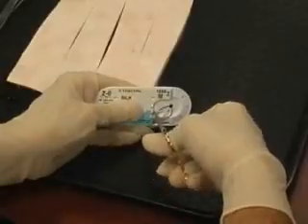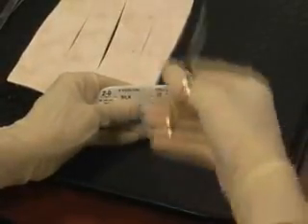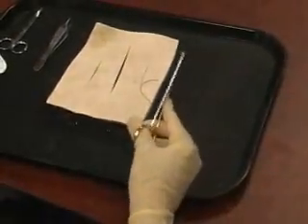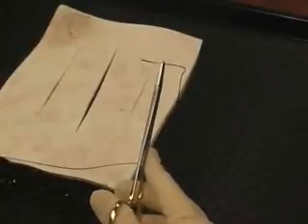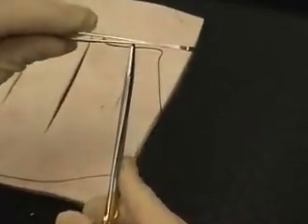So in other words, I'm not going to come down and turn around this direction. I'm going to come down as if I'm shaking hands. That's important. Once you grasp the needle, you can go ahead and pull the needle out and the suture material out, and what we're looking for here are a number of different things. This is all for a right-handed clinician, so everything is reversed for a left-handed clinician. But the needle is at the tip of the instrument, okay?